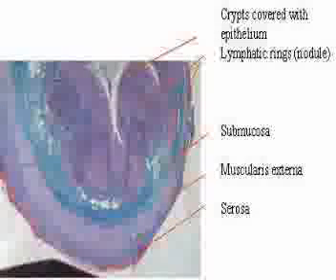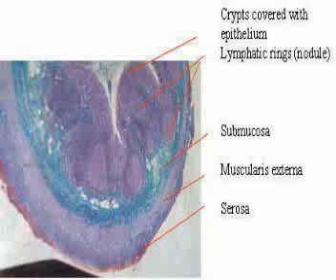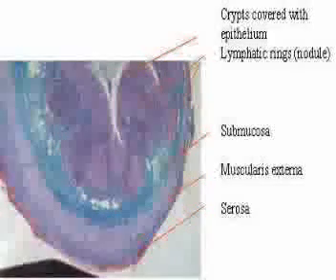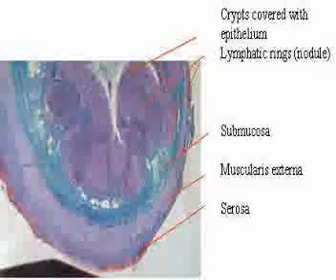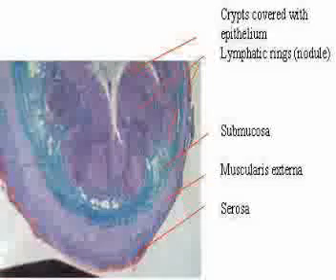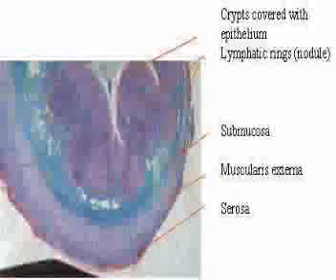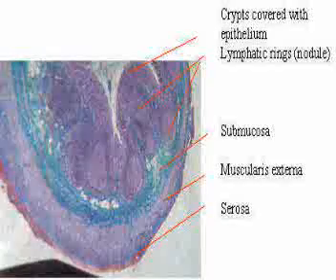Diagnosis of the appendix can easily be made out because of the lymphatic rings of the mucosa, which are purple, extending into the submucosa, which are green. Because of these nodules, the lumen is very small. The crypts of Lieberkühn are short, for the appendix does not do very much absorption or indeed secretion.